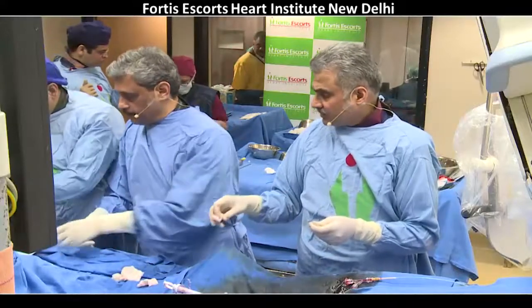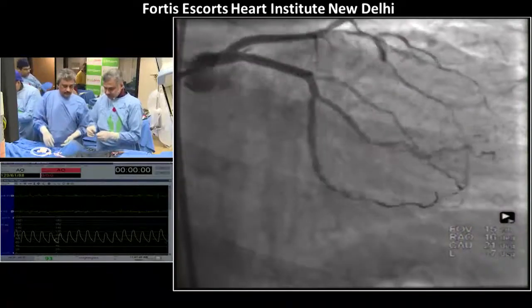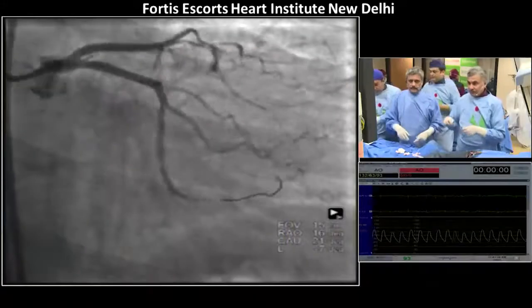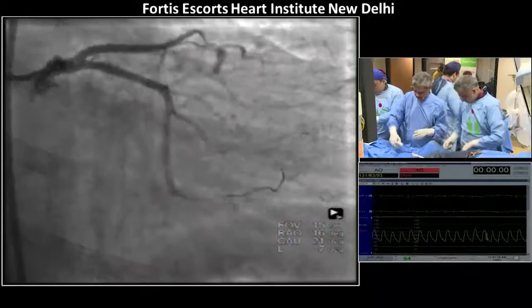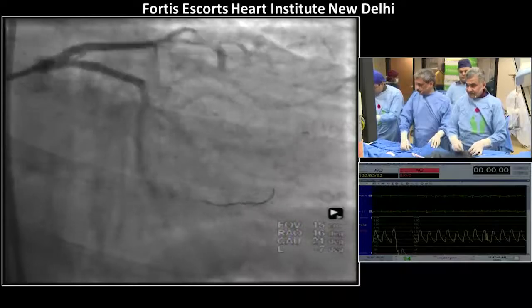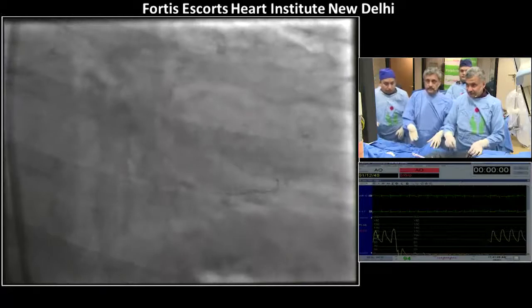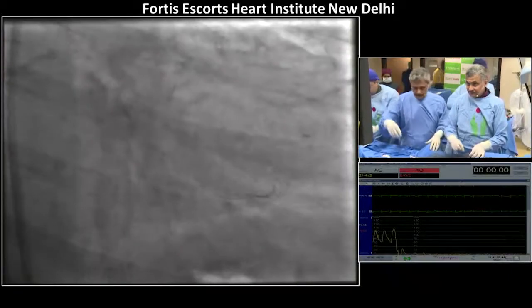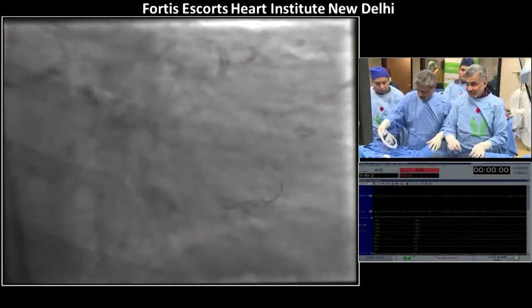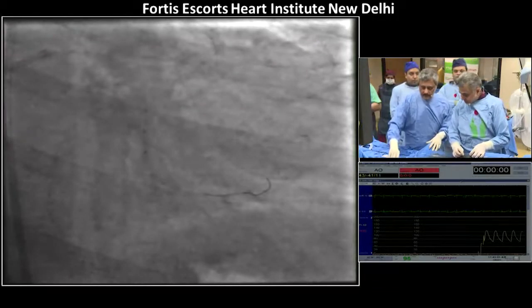This is a Pantera Leo, which is a very, very non-compliant balloon. Just the same class as your Quantum. All right, go. I hope it doesn't slip. No, it won't slip. I have full confidence. Okay, let us see. Can we check? Yeah, all right, let's do it.